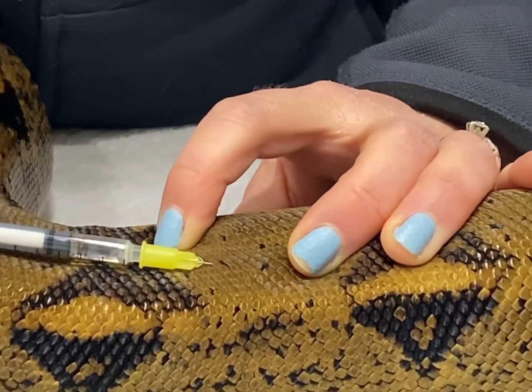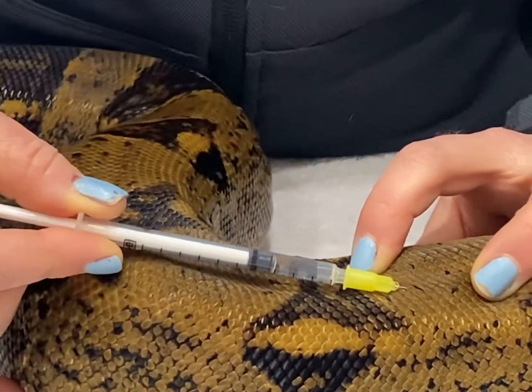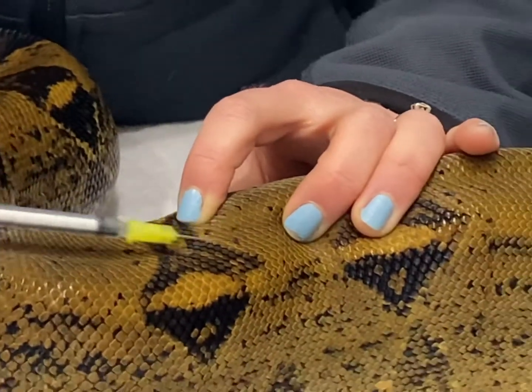You want to pull back on the plunger just a little bit to make sure you don't have any blood. If you get blood, just come out and start again. As long as there's no blood, you just push the needle in and then pull out.